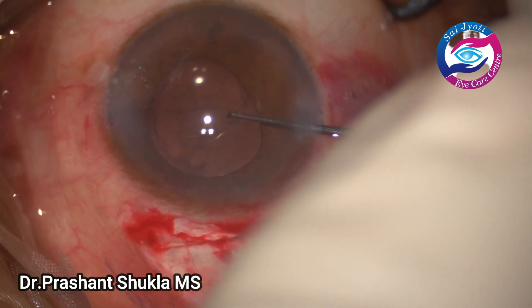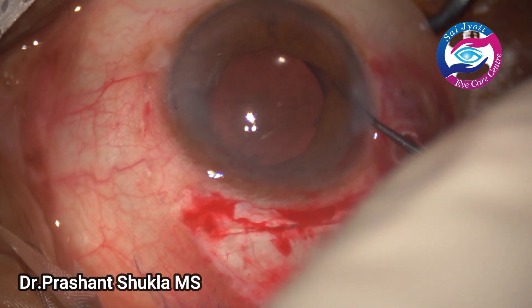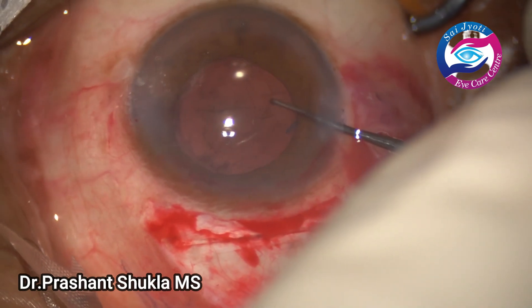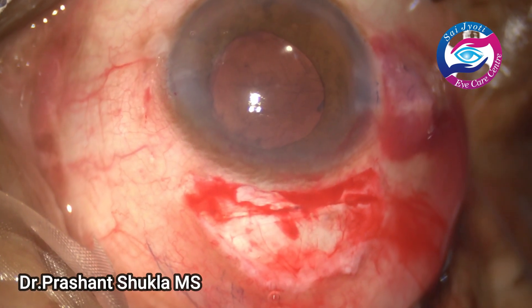I am checking whether the lens is in the capsular bag by retracting the iris. The lens is well centred and both haptics are confirmed to be inside the capsular bag.